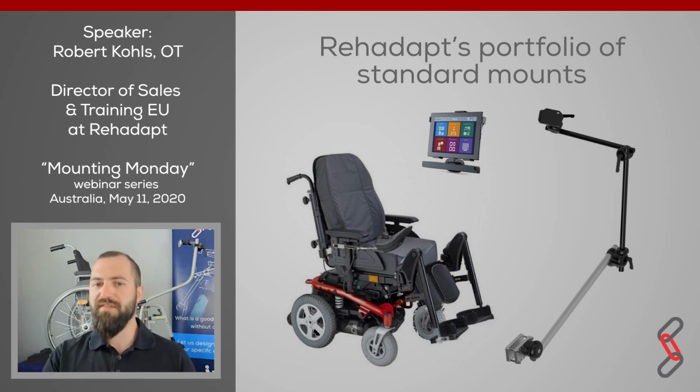This is another example of a power chair that should also be combined with an eye tracking system, with an iRespond Duo and Microsoft Surface solution. That means we can also use a very lightweight mounting solution, a hybrid. As you can see here, the silver tube is connected with the armrest. For all of you thinking, wow, stop, is it possible to mount on an armrest? I would not say to mount to armrests all the time, but if the armrest is stable enough to be connected with a good frame clamp and will not move in all directions, why not?